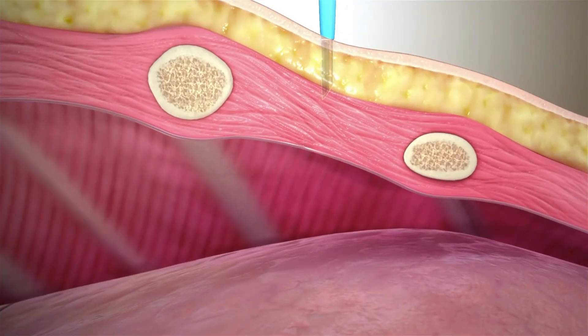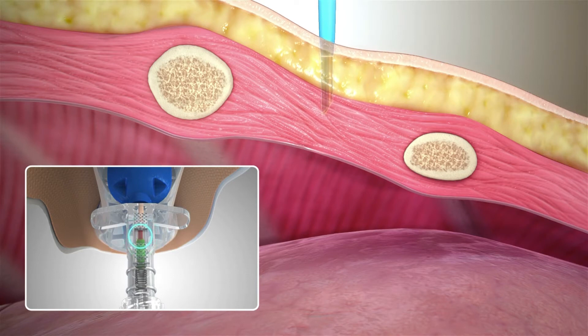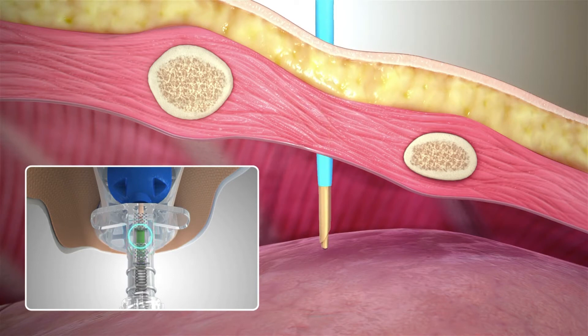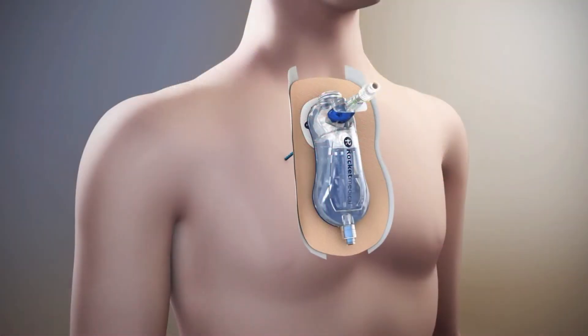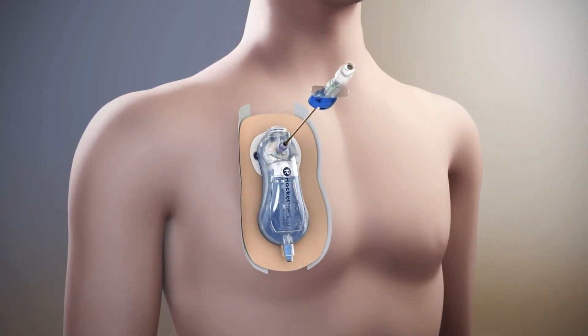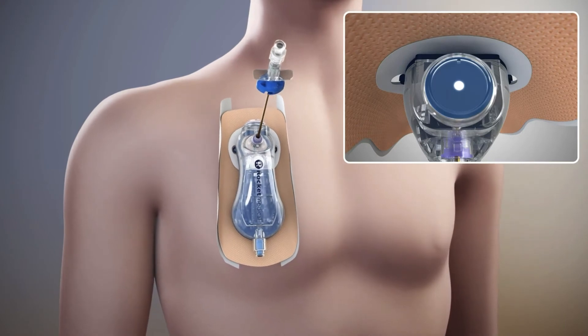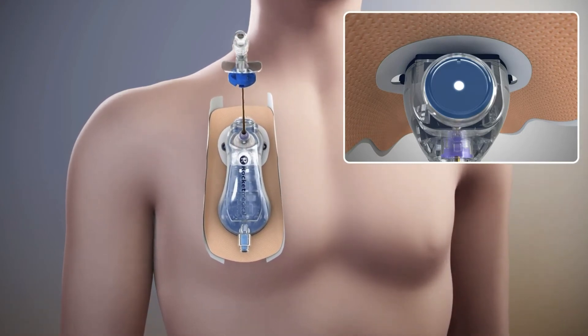As the catheter passes through the intercostal muscle, the indicator on the safety needle will show red. As the needle tip passes into the pleural space, the safety indicator will return to indicate green. Slowly remove the needle from the device whilst continuing to advance the catheter into the pleural space. At this point, the indicator diaphragm will begin to move up and down in time with respiration.